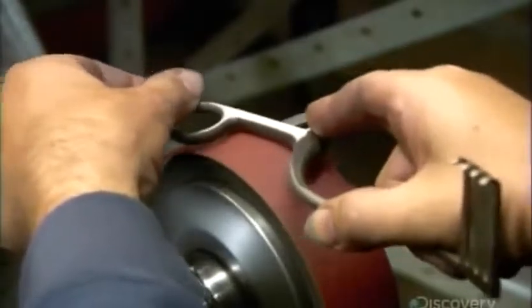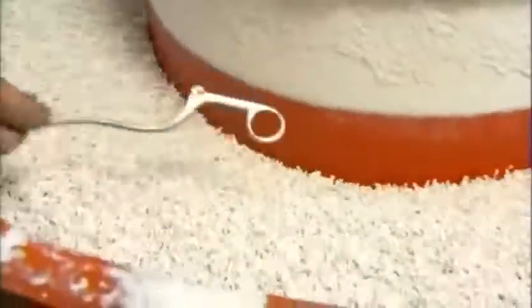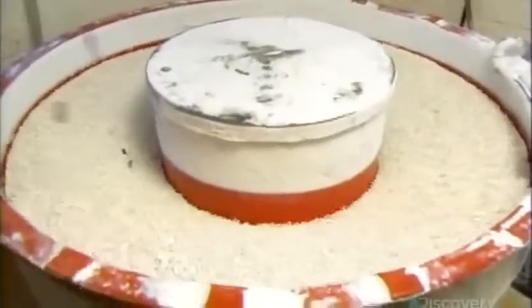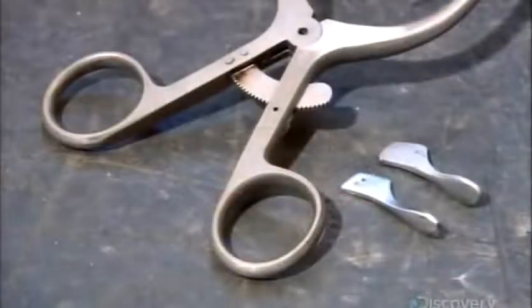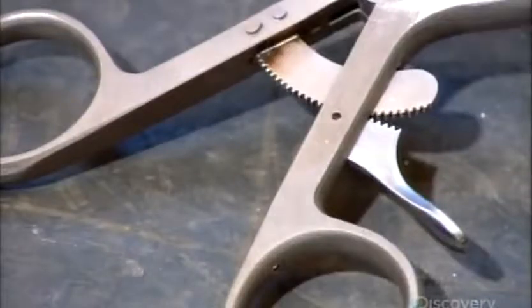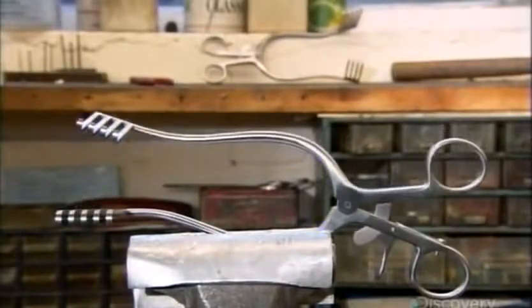After heat treatment, a worker sands all the tool components to smooth sharp edges. Vibrating porcelain chips and polishing compound scrub them clean and remove burrs caused by machining. Next, they install the pivot screw and trigger for the rack. By pressing it, the surgeon can open the prongs to the desired width and lock the tool in position.